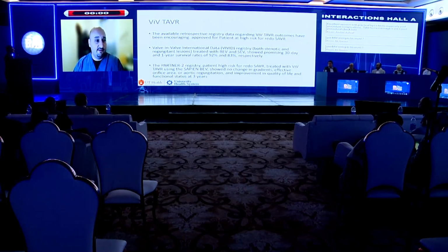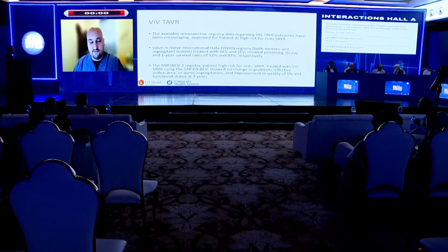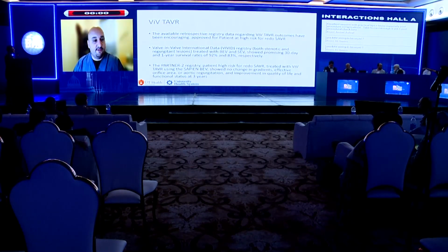The performance of valve-in-valve TAVR is good, with survival rates of more than 90 percent at 30 days and more than 80 percent at 1 year from the VIVID registry. That led to approval of these valve-in-valve procedures in a population at high risk for redo surgery.